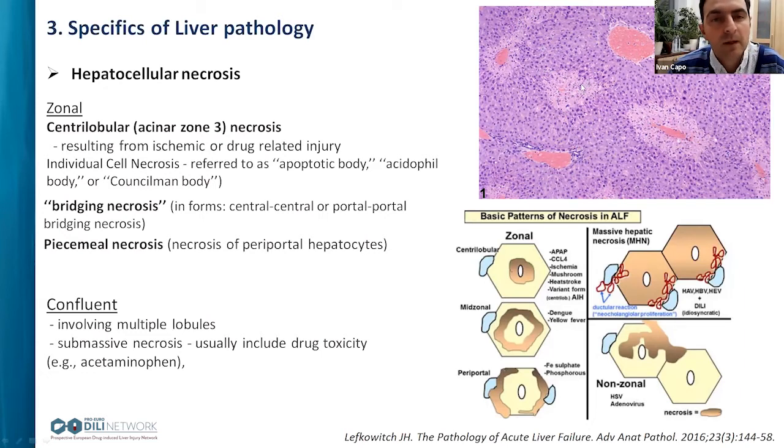If we see this histological picture, we can say that it is centrilobular necrosis. Here in the corner, we can see the portal space, which is not affected by this damage. This damage is highly connected with the passing of the drugs, because the highest concentration is here, and we expect that these hepatocytes, according to the cytoarchitectonic structure of the liver, are damaged first.